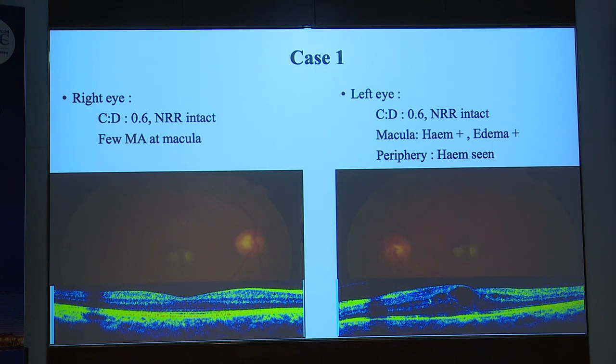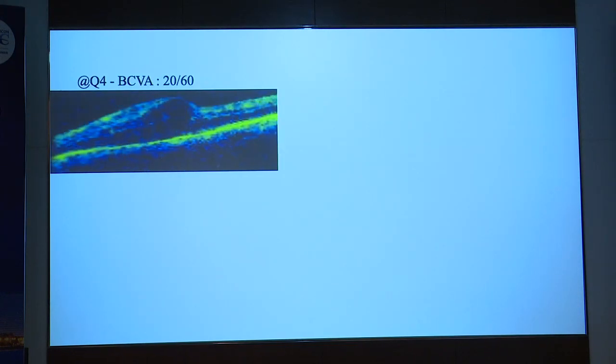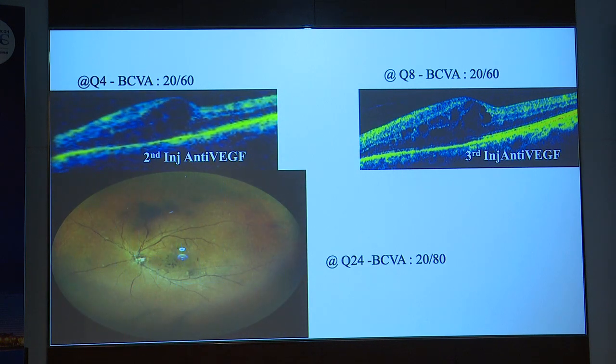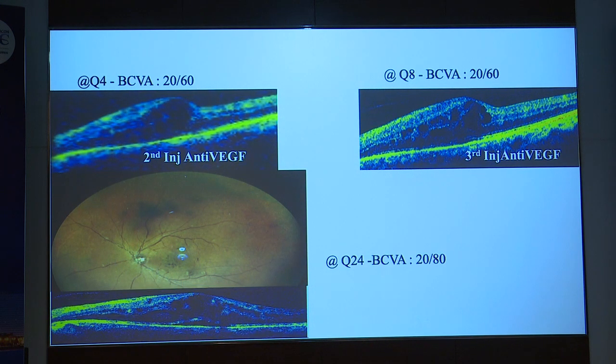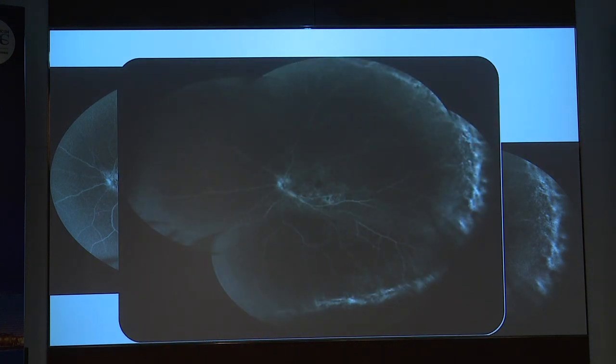He had macular edema secondary to it. This is what I did: an angiogram for him, and we treated him with anti-VEGFs. Every third, fourth week he would need further injections, and we did not understand how to proceed. By that time we had this machine, and we did an angiogram, and you can see the extent of disease over here.